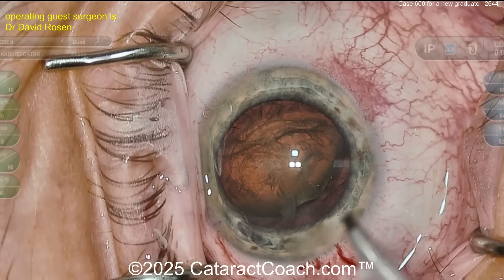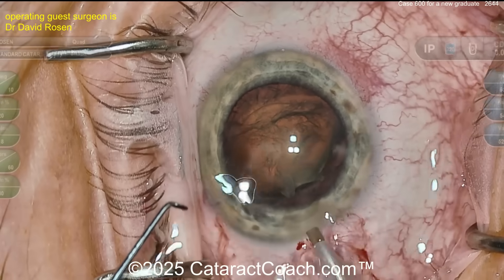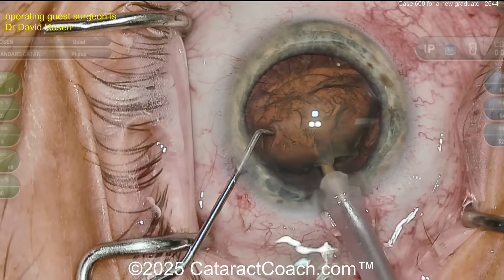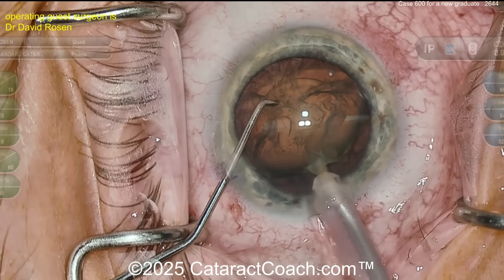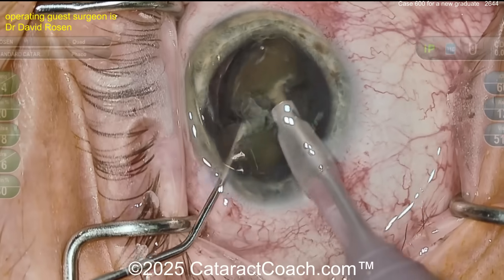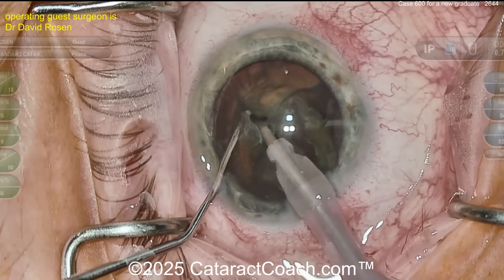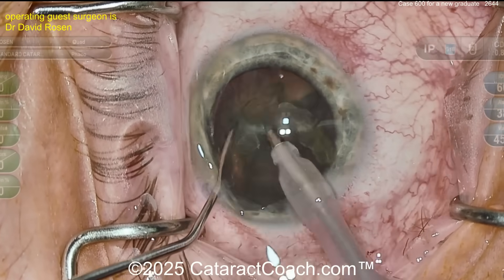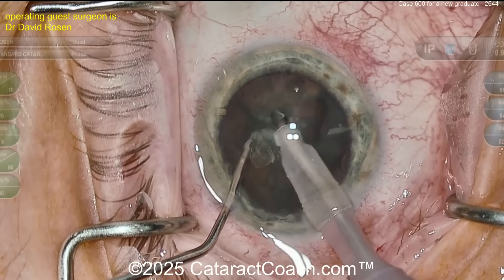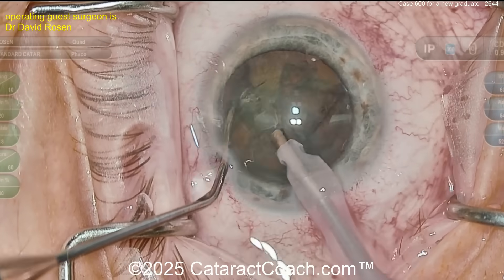The technique is probably going to be high vacuum, high flow. The parameters are a little bit blocked off on screen; I had to increase the zoom a bit, but that's okay — we don't need exact numbers. Go to CataractCoach.com, learn the phaco fundamentals, figure out your own settings. Now buzzing with the phaco probe right at the lens, and then the chopper goes in — two halves, just like that, beautifully done. I like how the eye stays in primary too. Good pivoting in the incisions; not a super dense cataract but that's very typical.